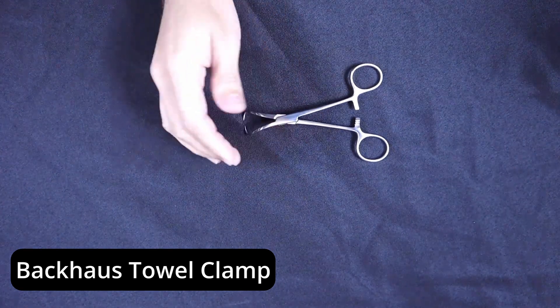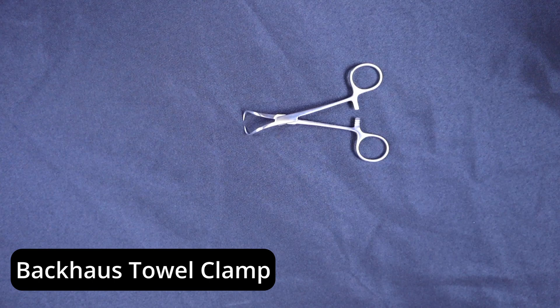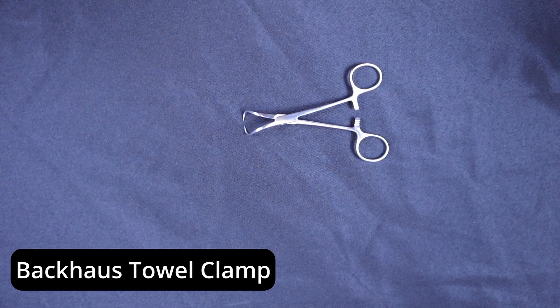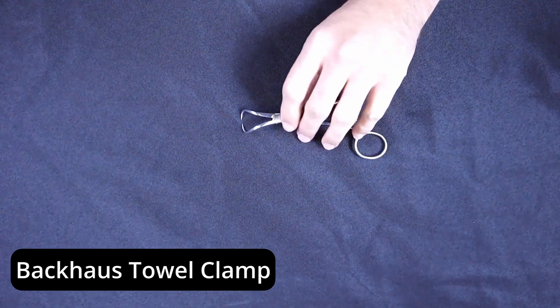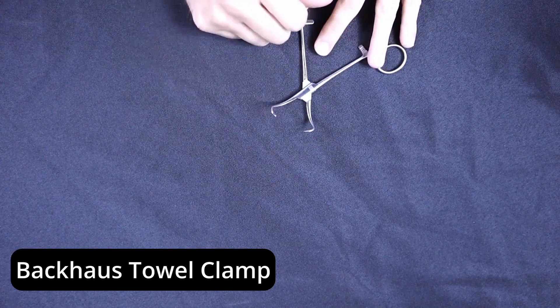The nice thing about this instrument is it's very different looking from the majority of the clips and clamps that you would see in a traditional surgical tray. What is very important to realize is this is one of the most common instruments that can cause injury in the cleaning and assembly stage because the tips of this device are so sharp.